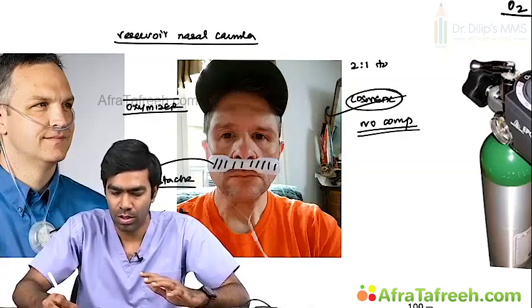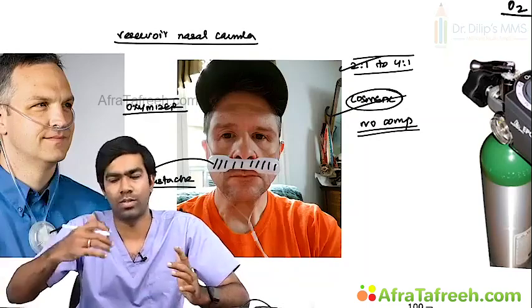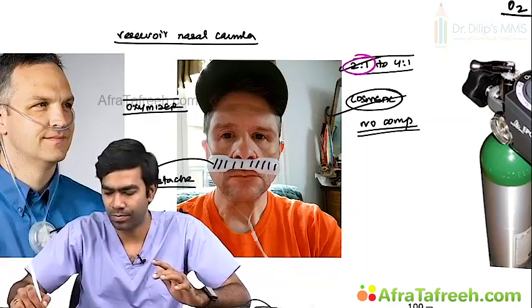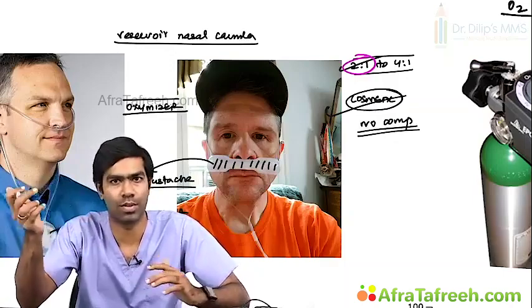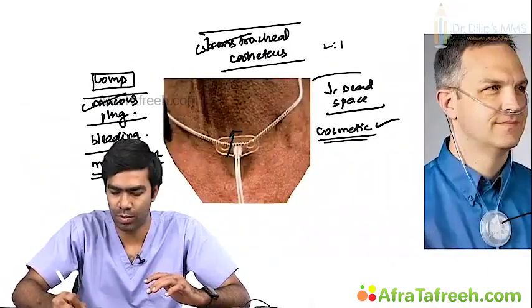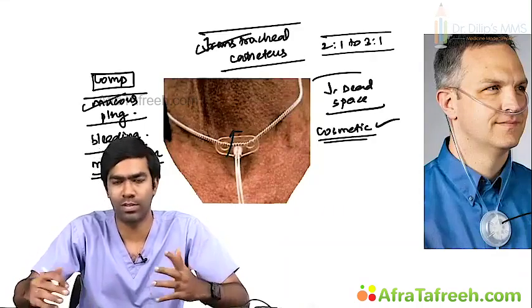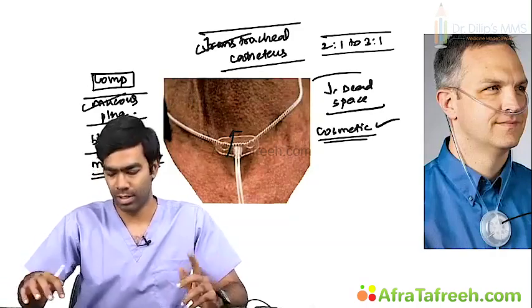Almost 2:1 to 4:1. I told you, in the sense that they reduce the oxygen requirement by half. That's why I told you 2:1 to 4:1 efficiency compared to the nasal cannula. Transtracheal catheters have an efficiency of 2:1 to 3:1, very similar to that of reservoir cannulas only. So whichever the patient is comfortable with, you can ask them to get that. Clear?